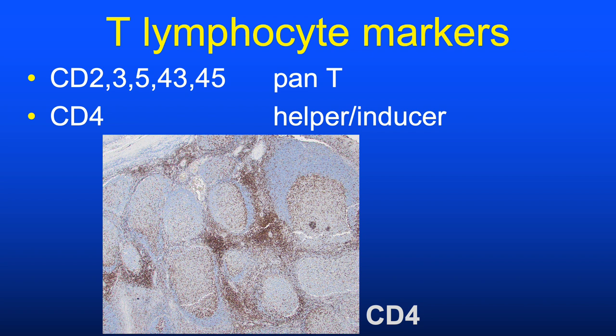A comprehensive review of all CD markers is impossible, but some highlights: the low numbers—CD2, 3, 4, 5, 7, 8—are typically T-cell markers, some pan-T-cell and others more specific. Here's a CD4 stain on lymphoid tissue—most lymphoid follicles and mantle zones are negative, but there are scattered T-cells in the follicle center (follicular T-helper cells), with most cells being interfollicular.